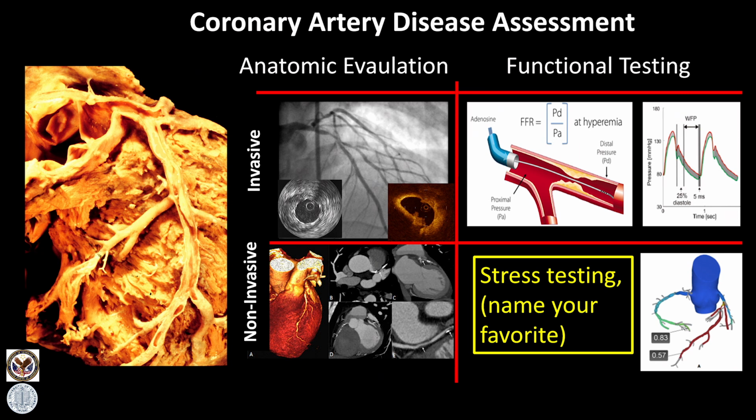and we have advanced our knowledge base through the use of intravascular ultrasound imaging, the small gray and white image in the corner on the left, and through intravascular optical coherence tomography imaging, the smaller insert on the right. These give us anatomic information of lumen size, wall composition, and surrounding features, but again are limited in looking at whether flow through such a vessel is normal or abnormal.